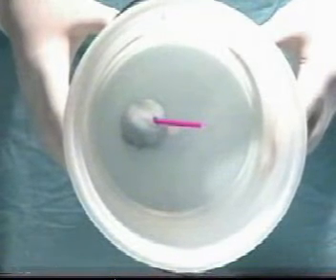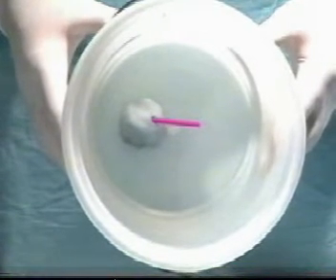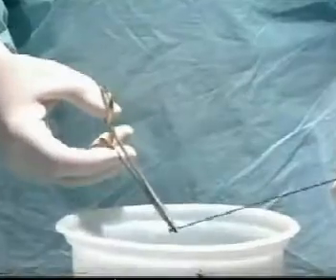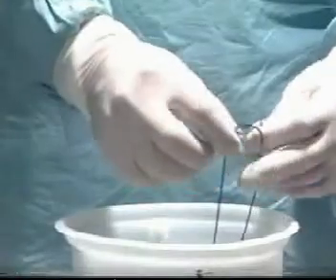Let's look at a model for tying a depth in the pelvis. Here is a simulation of a small blood vessel deep in the pelvis, made from a straw and a blob of blu-tack. Take your suture material in the tip of a hemostat and pass it round the blood vessel, taking great care not to exert any tension.